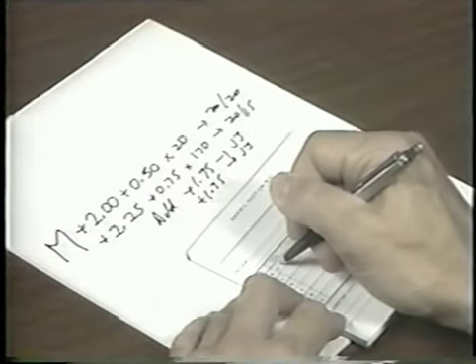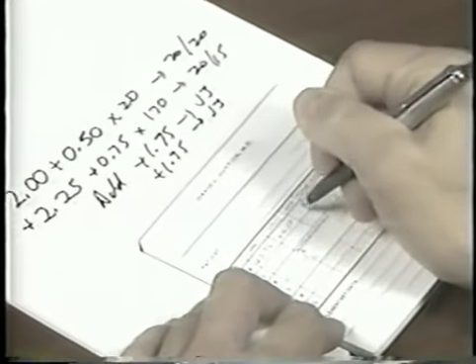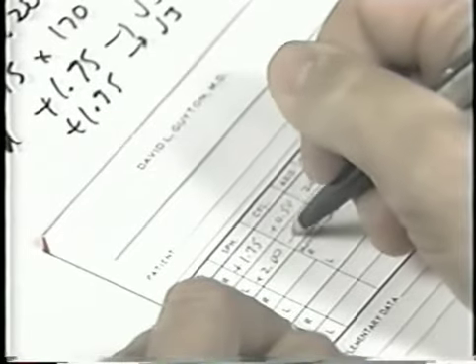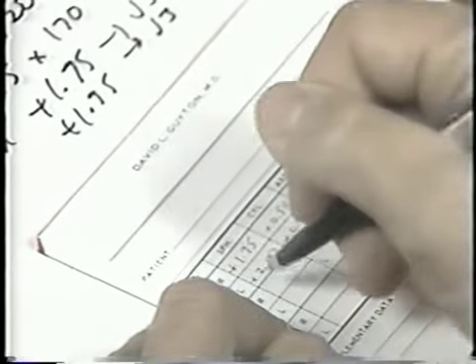Prescribing is the final step, taking into account the type of refractive error, the patient's age and needs, the old glasses, and so forth. Often the refractive findings must be altered for the new glasses to be accepted comfortably. This concludes our program on subjective refraction.